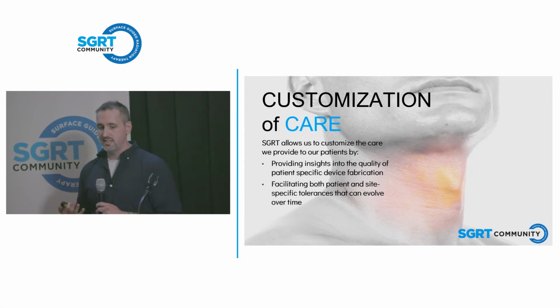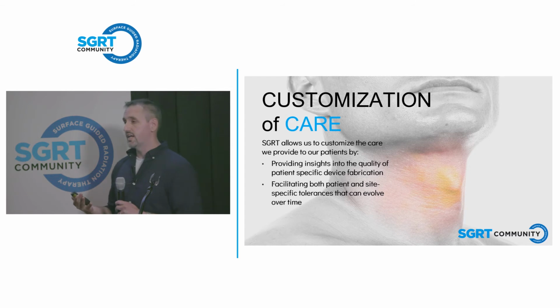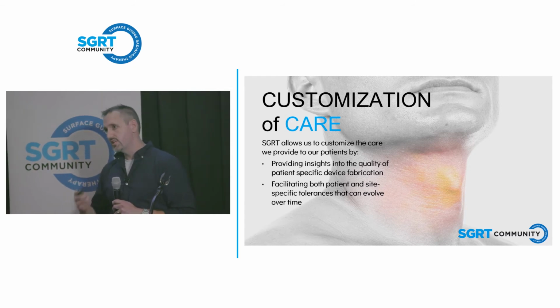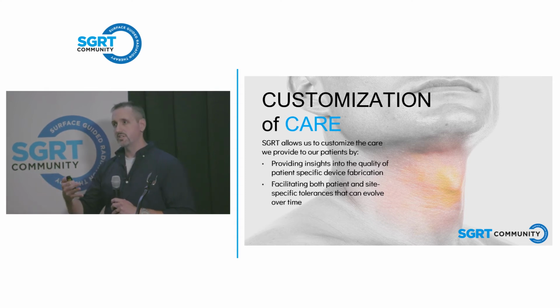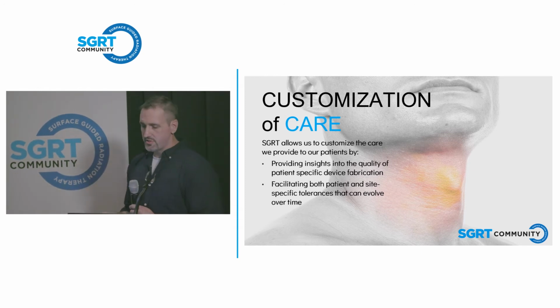It provides insight into the quality of a patient-specific device fabrication. So now we can look at how well we're doing on our fabrication of our devices, not just assume we make every mask the same way and they're all good. Facilitating both patient and site-specific tolerance as well. Something that we like to evolve over time. As staff gets better and better at doing something, the tolerances should get tighter and tighter to avoid type 1 and type 2 errors. A good example of this, I use this in all of my talks.